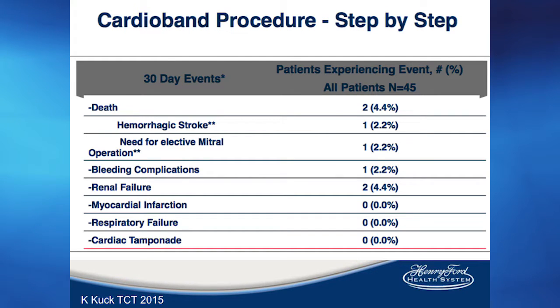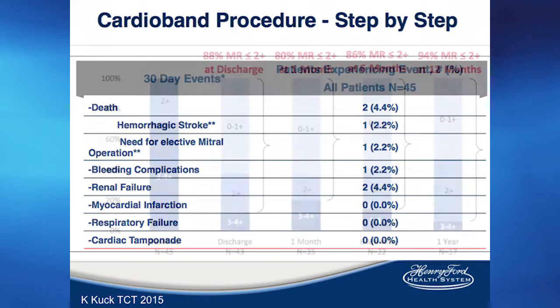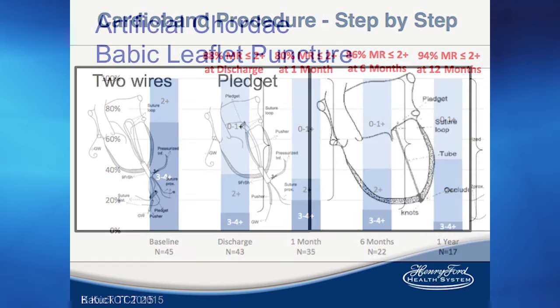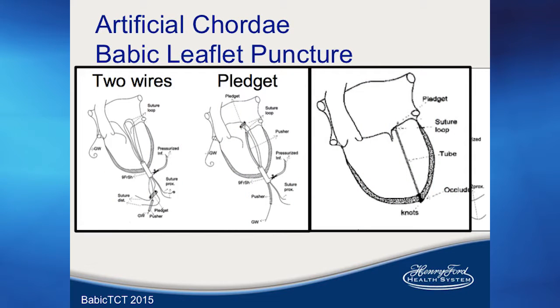Actually, I think there are some being done. I think Baylor is a site, and they're implanting some in Texas. And again, early results show that it's mostly positive, but it's still pretty early, although their cohort's a little bit bigger. It was 45 patients.